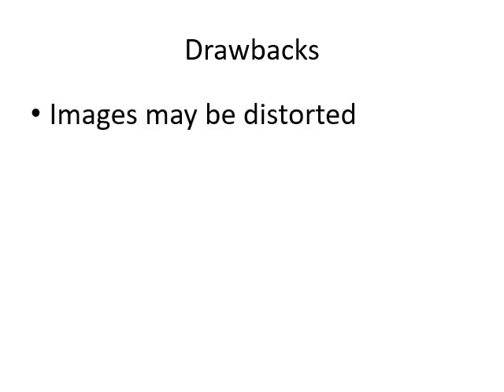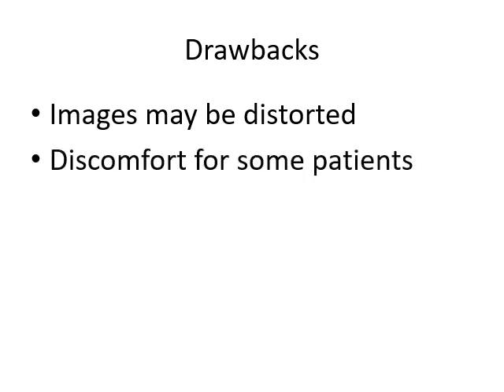Now, all right, so what are some of the drawbacks of using an ultrasound? Well, sometimes the images are distorted, so they're not as nice and clear as you would hope them to be. It's not as clear as an X-ray.